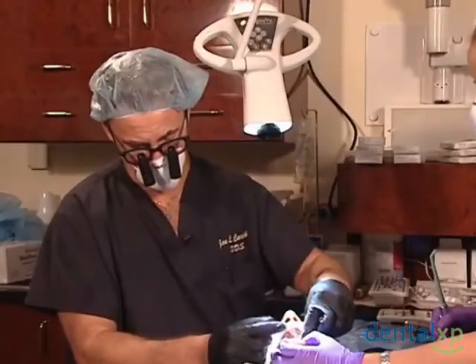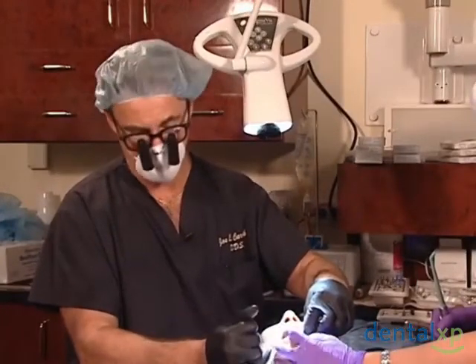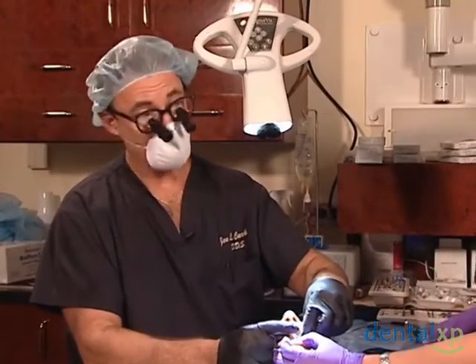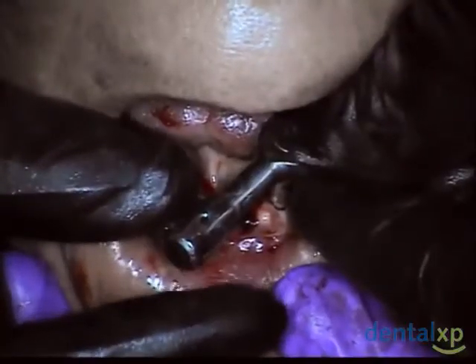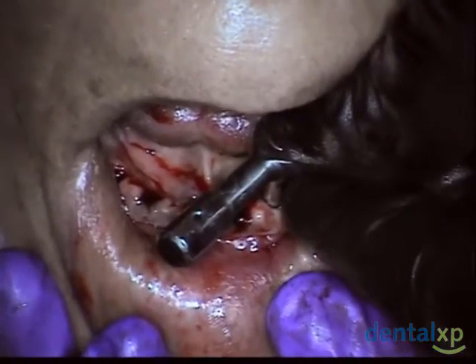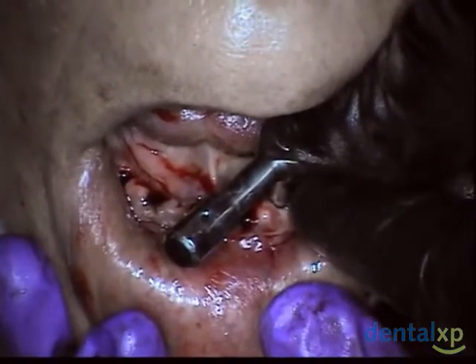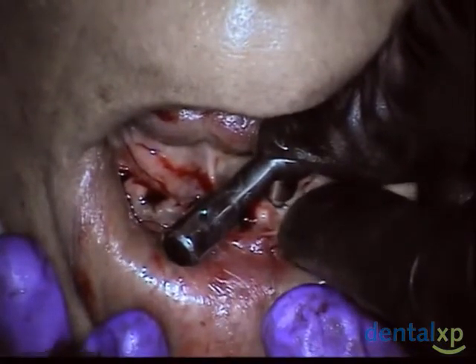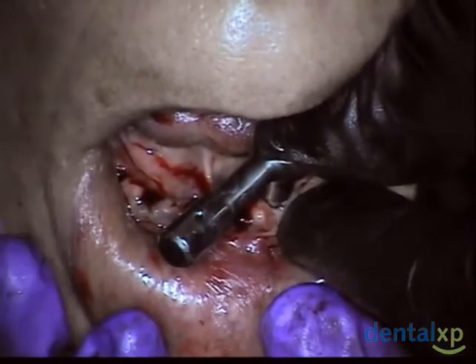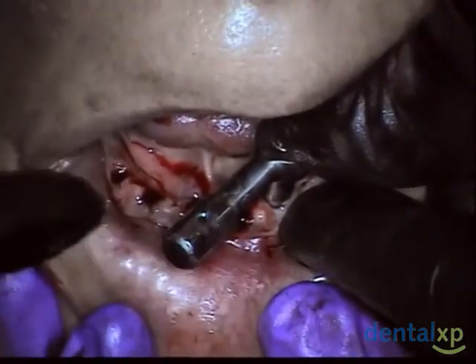Why did I not tap? Because I'm experimenting, if you will, or deciding what protocol I'm going to use in this particular bone. If I can't get this to place with the proper amount of force, or get it seated, I'm going to remove the implant, and then I'll tap. What I'm doing is making the bone in that area less dense, so that I'll be able to place the implant with the appropriate amount of force. I may go in and tap halfway. And if I still can't seat it, then I come back and tap it all the way. Once I find the sequence on this side, chances are I'm going to use the same sequence all throughout.